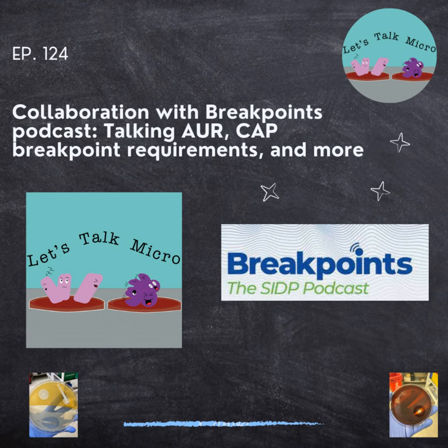So definitely a lot of information Dr. Alexander touched on, right? Knowing what breakpoints you have, and then what are you using? Are they FDA? Are they CLSI breakpoints? And then also knowing from what publications or what year they were published, and when they were last revised in the lab? So that's definitely very important.